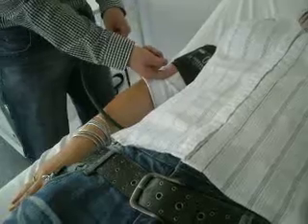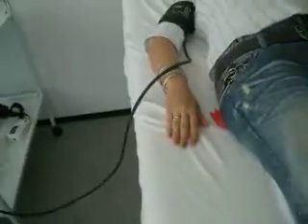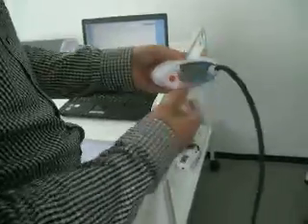So my finger can just hardly be inserted beneath the cuff. And this is how you attach the tube to the device. So that's how you make the system ready for the measurement.